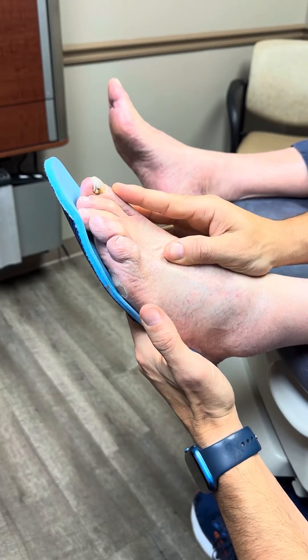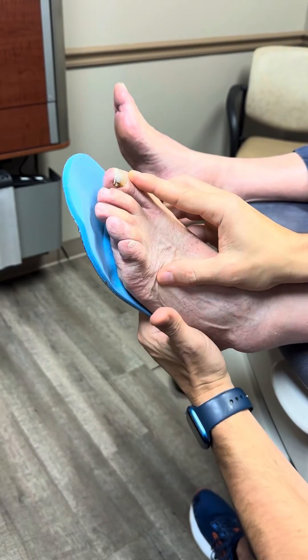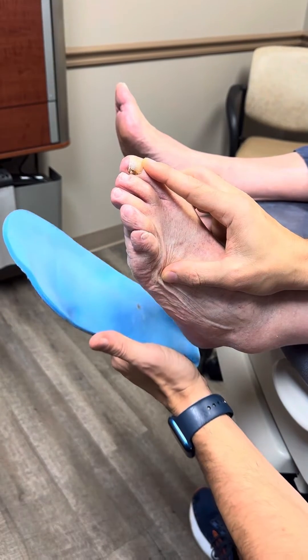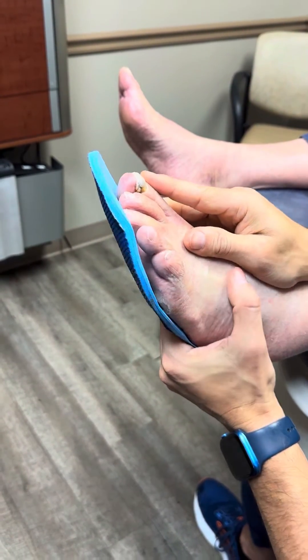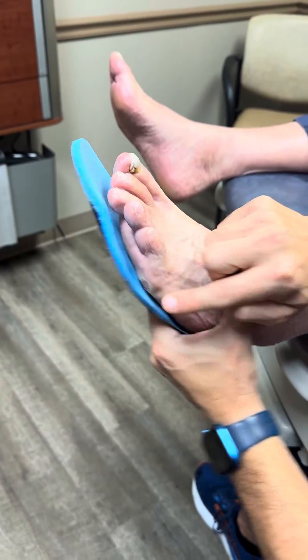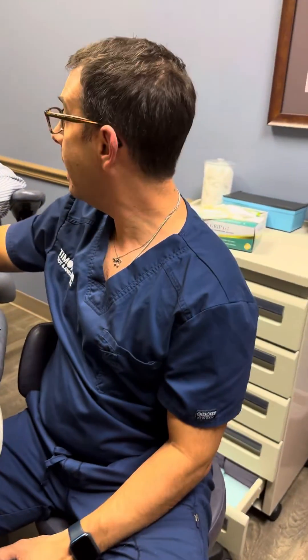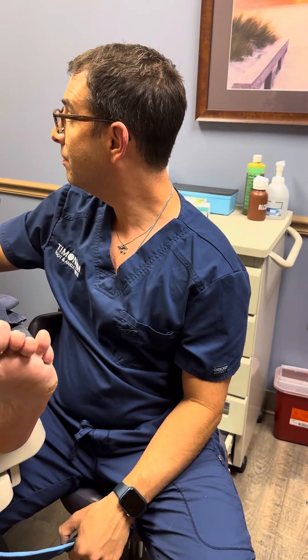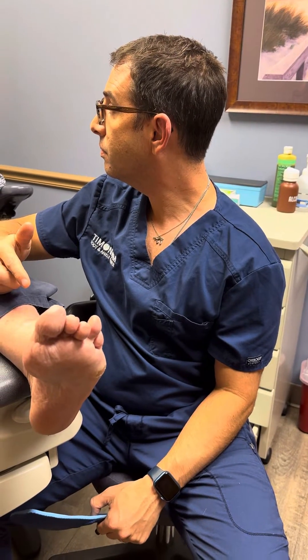We're floating the pressure off of this spot of his foot, and it's stabilizing his ankle as best it can from rotating. So when he's walking, he's no longer walking on the outside of his foot. The orthotic is actually pushing and holding his foot like this, taking the pressure off the spot. How much better do you feel? A hundred percent. And your pain? The pain on the callus is not there.